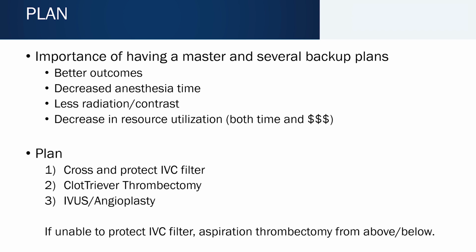It is really, really important to have a plan as well as several backup plans when tackling the more complicated deep venous thromboses. First off, you're going to always have better outcomes if you have these things planned out ahead. You're going to drastically reduce the amount of time that patients are under anesthesia. You're going to reduce your radiation and contrast use during the surgery. And you're going to overall decrease your resource utilization, both in terms of time as well as money.